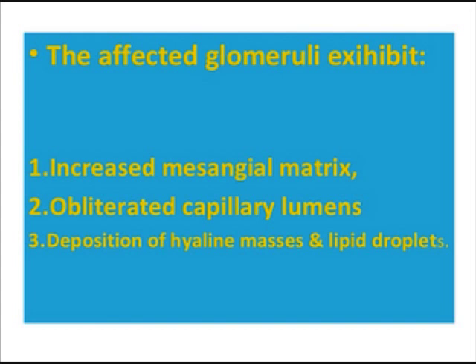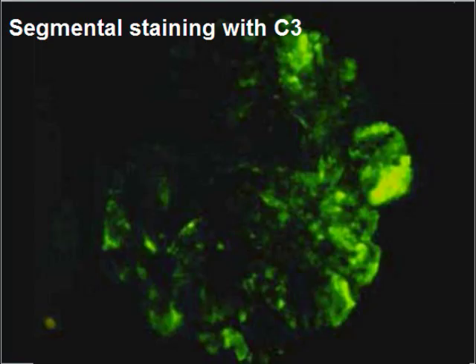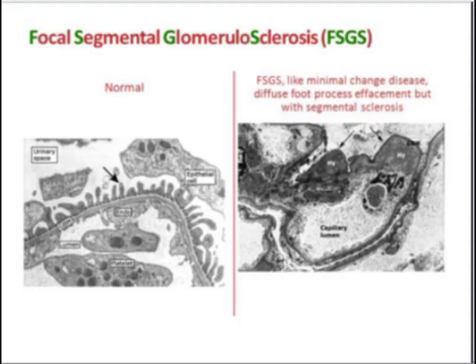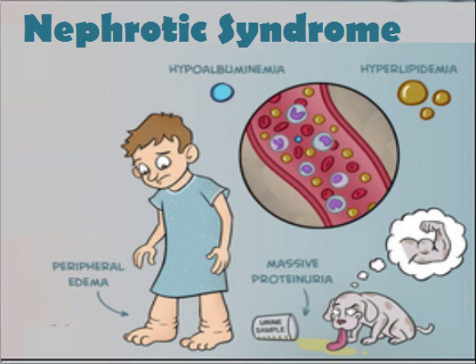On microscopy, the affected glomeruli exhibit increased mesangial matrix, obliterated capillary lumens, and deposition of hyaline masses and lipid droplets. Here is the histological view of segmental sclerosis and segmental staining with C3 complement. This is the electron microscopic view showing injury to the foot processes.